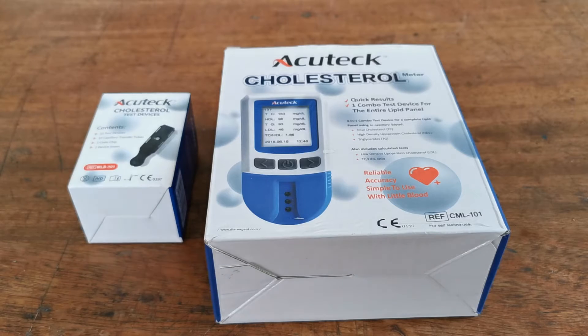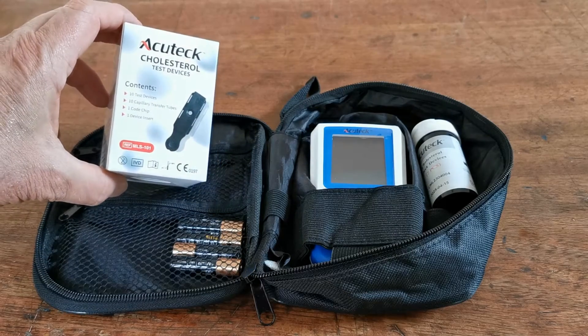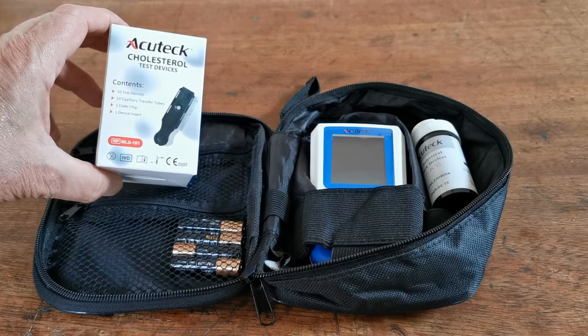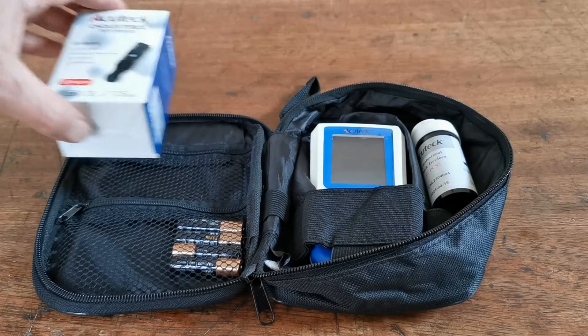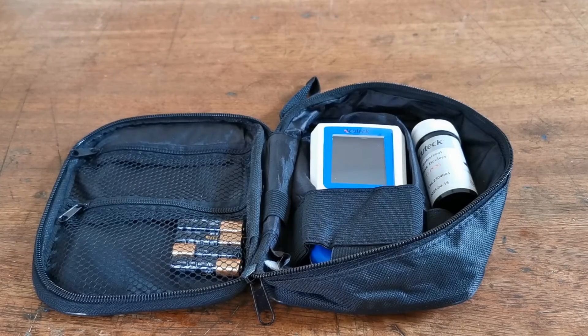Let's show you what's included inside the box. Unboxed, you have a set of instructions, which we're not showing today — we do a full video on instructions separately. You will have purchased a pack of a minimum of 10 test devices in the same branding as the meter. Some bundles include 50 test strips, and they will include the test code chip that we're going to use in a moment.